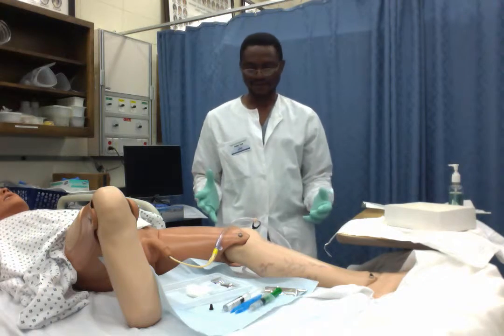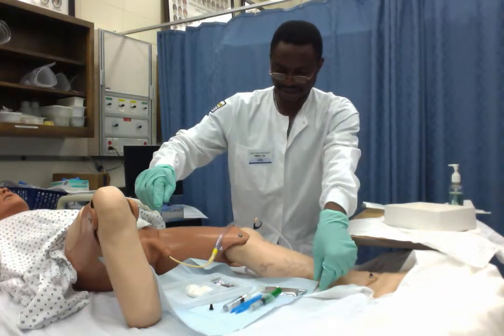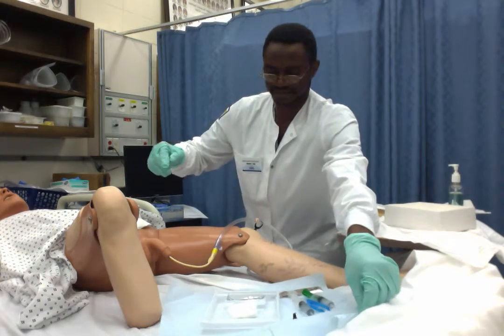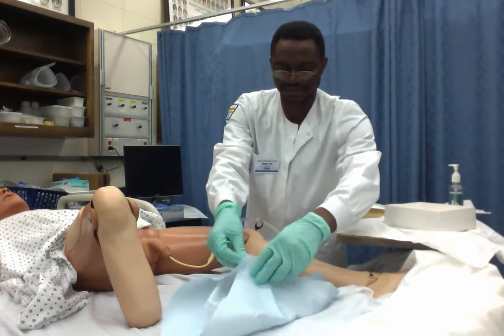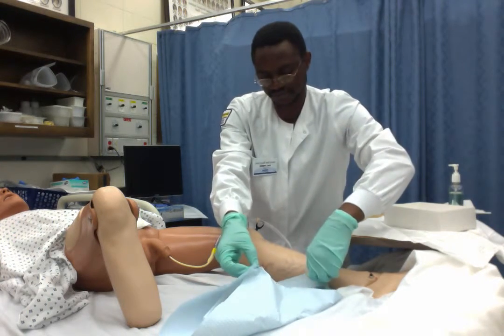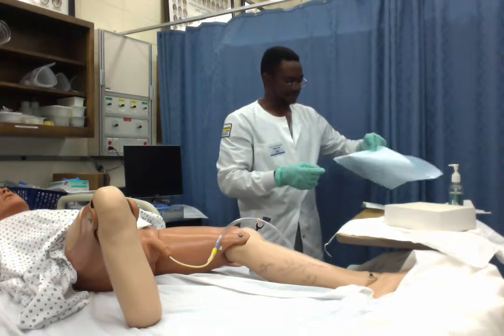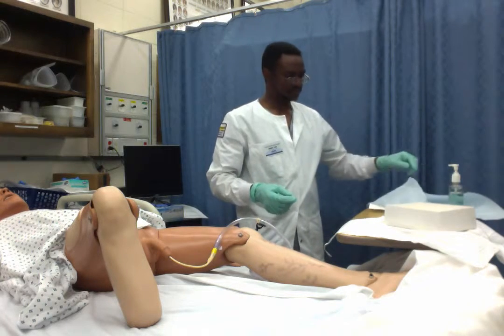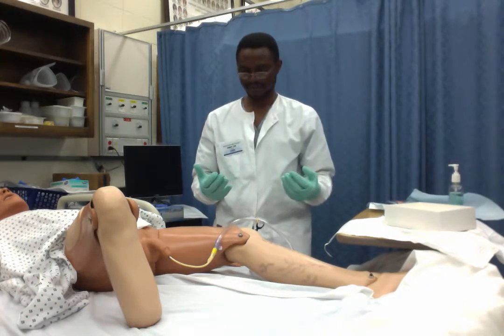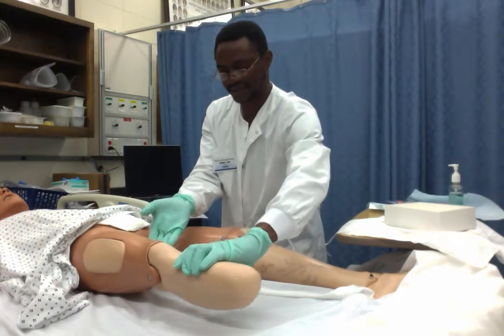So the catheter has been inserted. I will now clear off my sterile field, receptacle field, and discard of it. And I will make sure I return my client to a comfortable position.